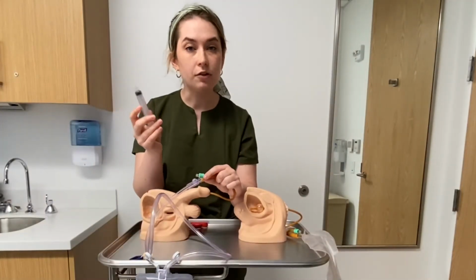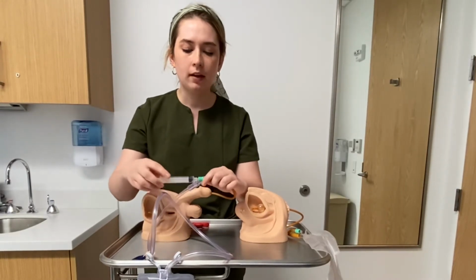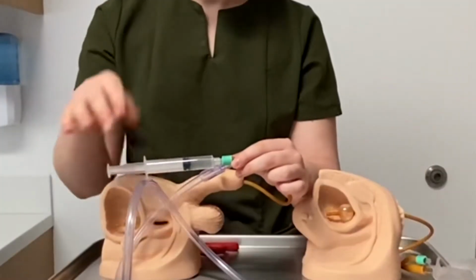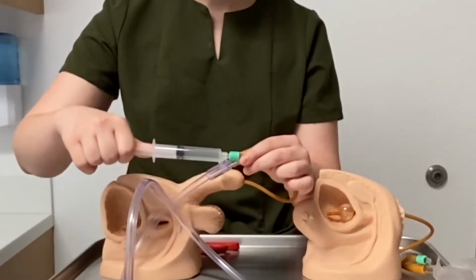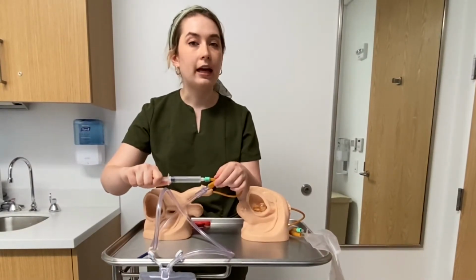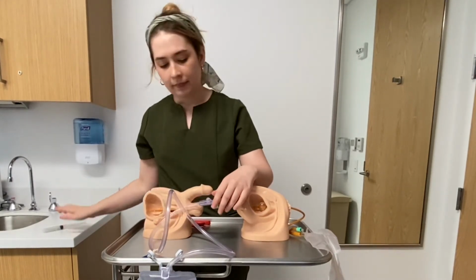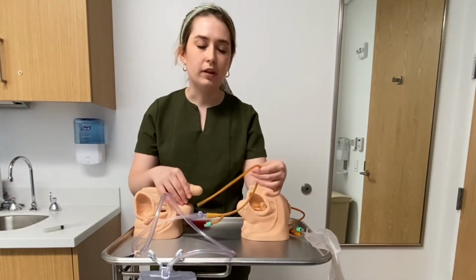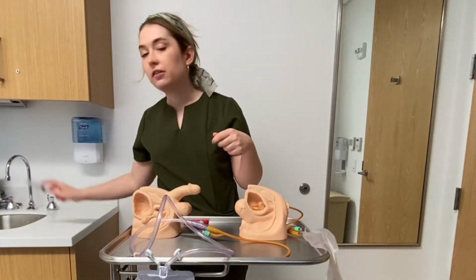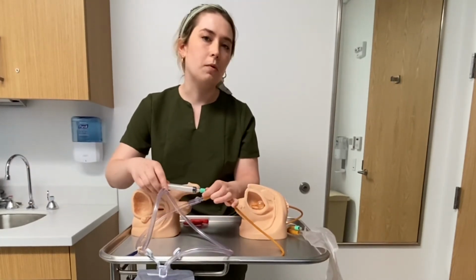I'm going to use an empty new syringe and attach it to this port, and it should start deflating the balloon on its own. If you need to, you can pull back on the syringe, just using a little bit of force. Once you pull back and you're no longer getting any fluid or air, you can disconnect the syringe, and at that point, you can easily remove the catheter. If you're having any resistance, just empty your syringe and try to pull back on the port once again and ensure that it's empty.